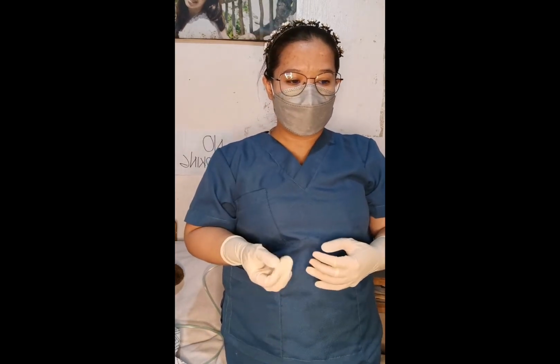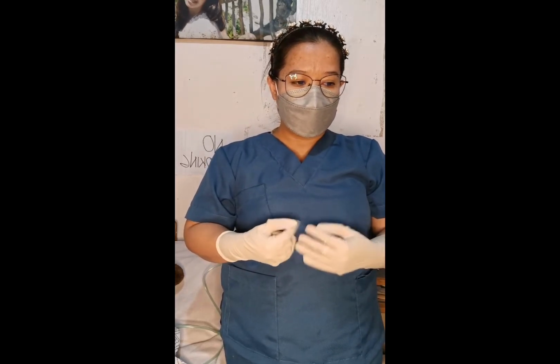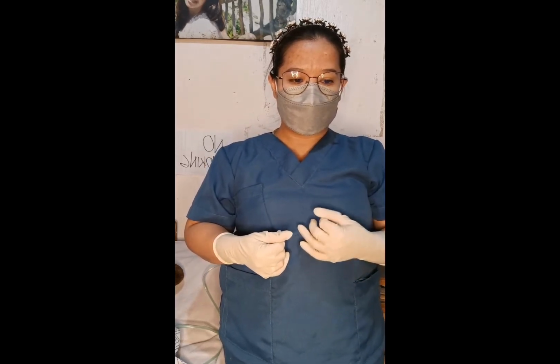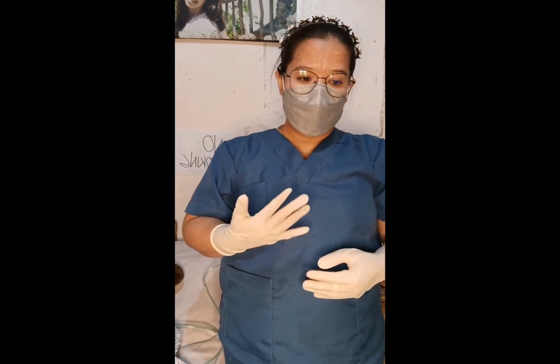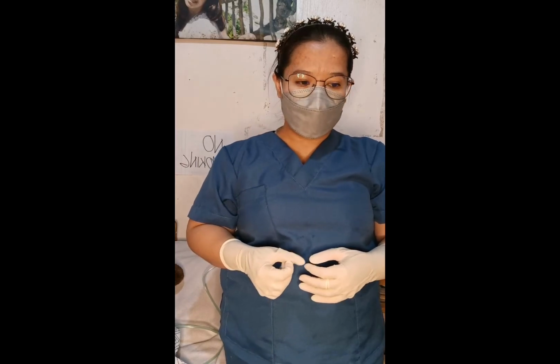We need to explain the procedure to our client, explain to the client that the oxygen will ease discomfort, and inform the client concerning the safety procedure associated with oxygen use. We need to encourage him or her to breathe through their nose.